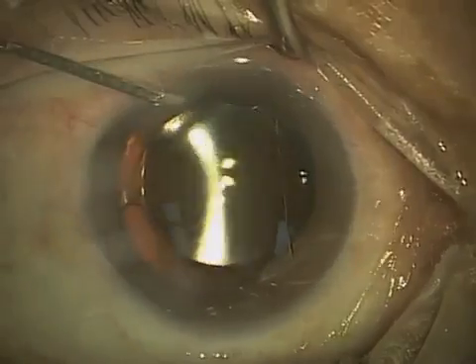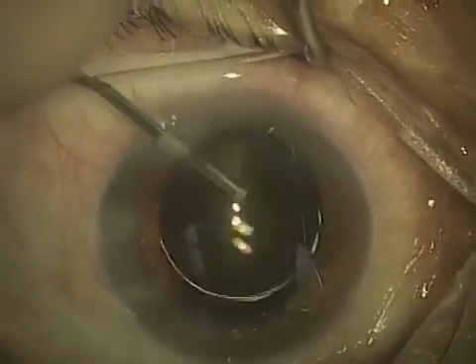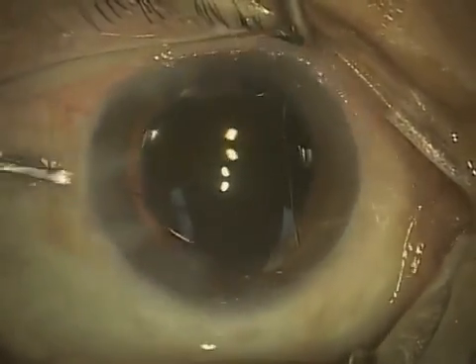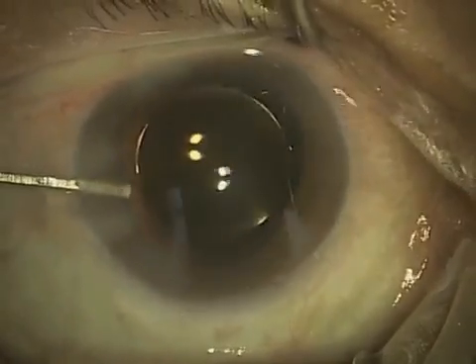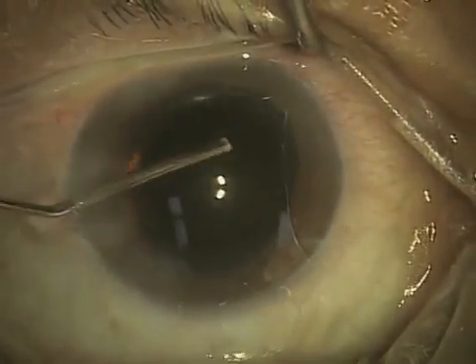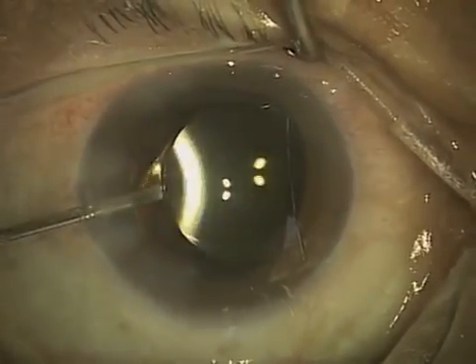Now what I'm doing is hydrating — basically using pressurized saline solution to close off the little paracentesis or side incisions that were made with the one millimeter diamond blade earlier, injecting some special saline solution into the eye itself, making sure that the lens is well centered and in a good position.